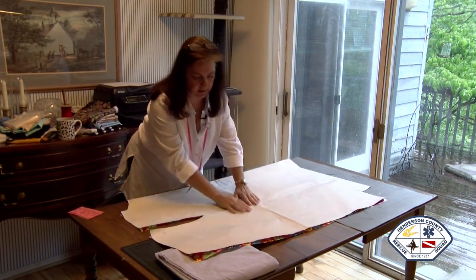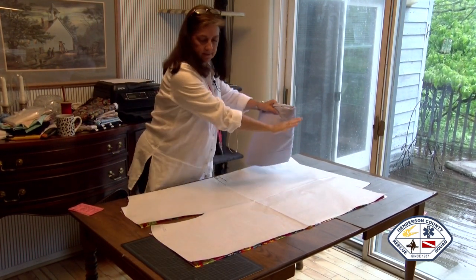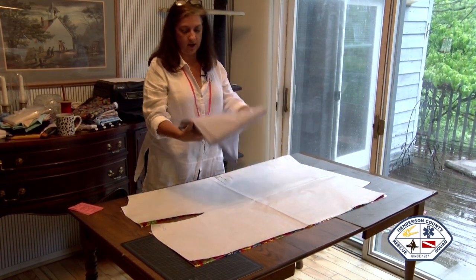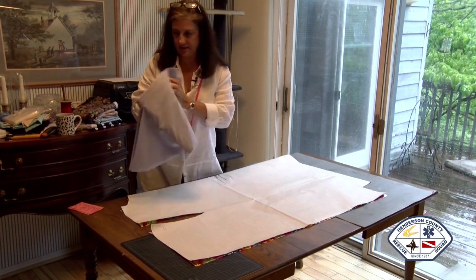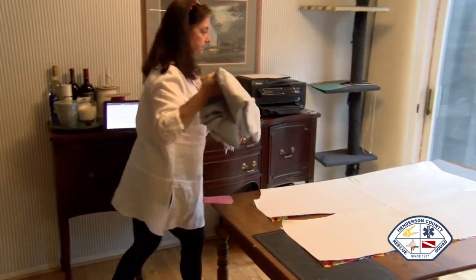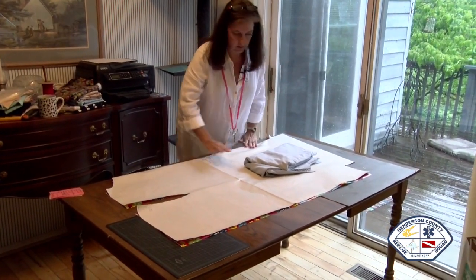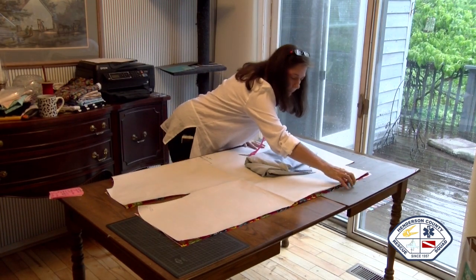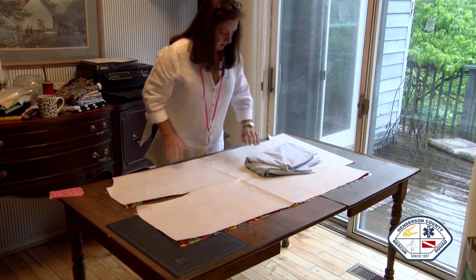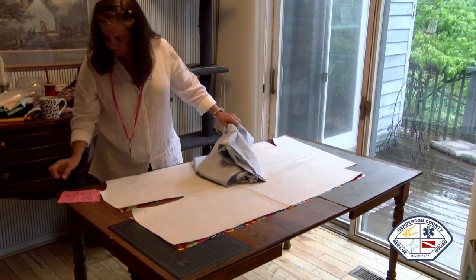Okay, I have cut my fabric 57 inches long, 44 inches wide. This is just a sheet. Now, on your pattern, let's get that flat. Okay, I've got my handy dandy notes.